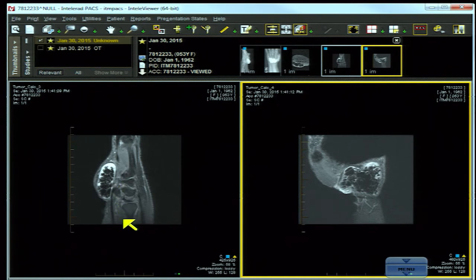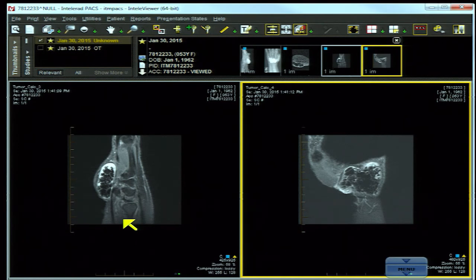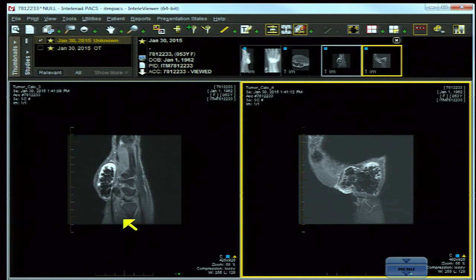In contrast to myositis ossificans, which demonstrates the zonal phenomenon — calcification or ossification from the outside in — this lesion ossifies or calcifies from the inside out, a key diagnostic feature on MR and radiographically. These patients may have dental abnormalities. Multi-focality is not uncommon; in fact, the average number of lesions per patient is three. This diagnosis is tumoral calcinosis.